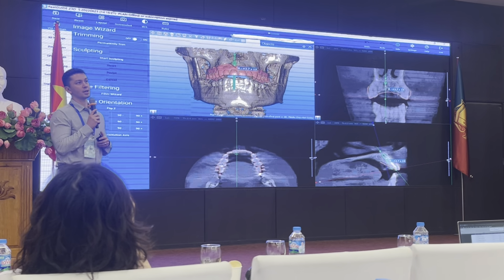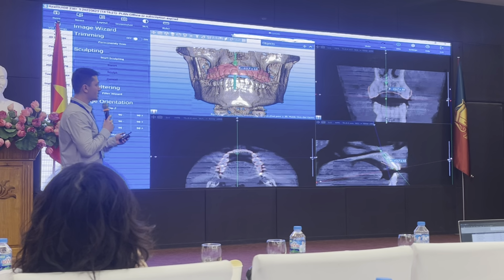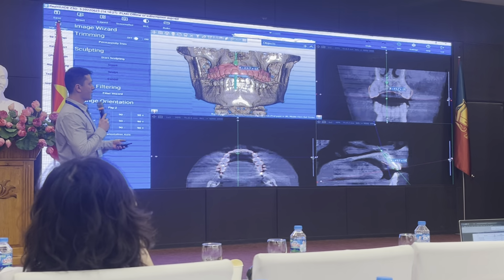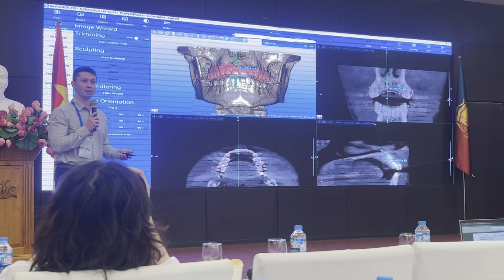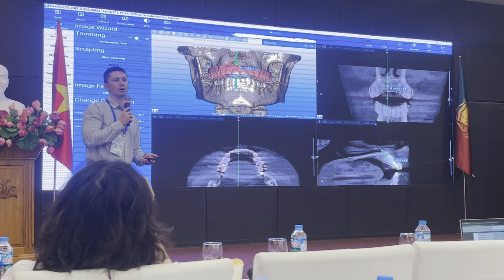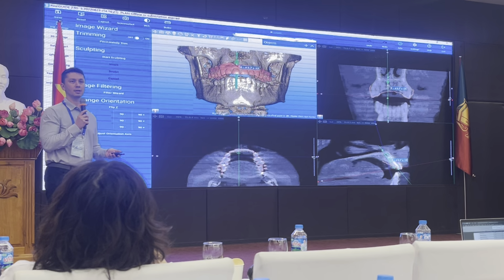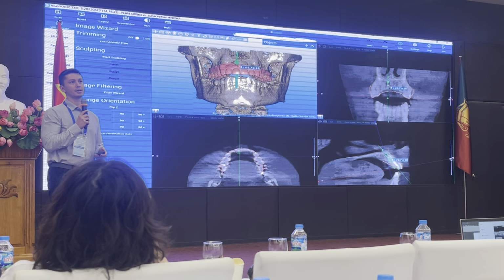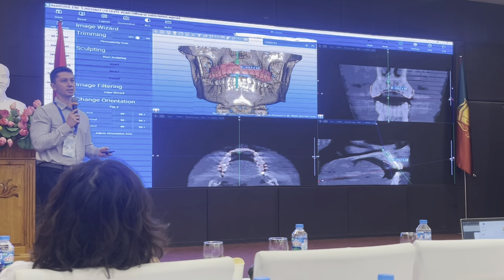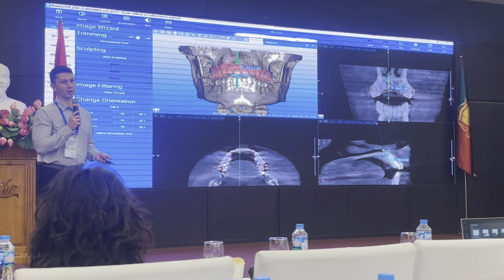I like to use an allograft bone grafting material to help regenerate the site, and then sometimes you just have to graft and wait and cover the site with a collagen membrane. We've been using collagen membranes for the past 2 days in the clinic this week, and sometimes that's what you have to do to regenerate the bone, to establish a proper foundation to place a successful implant.